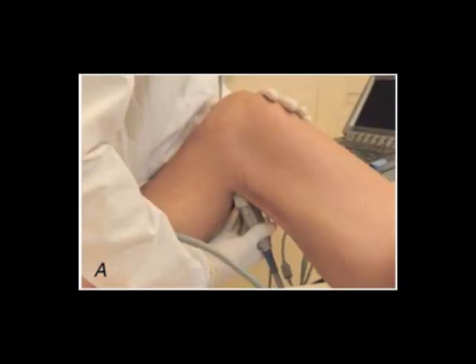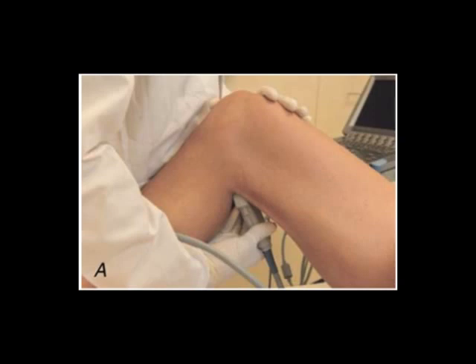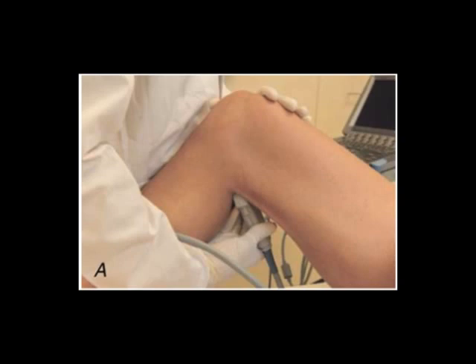With regards to scanning in the popliteal fossa, at this level the vessels have moved posterior in the leg and lie behind the patient's knee. In order to get good images of this area, the probe is held facing towards the sonographer.